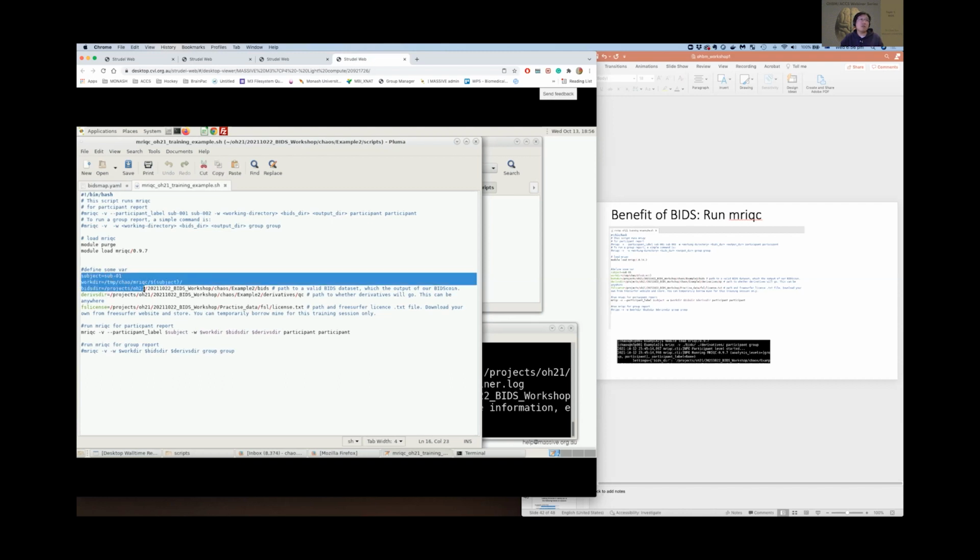And here is the variable design. It's like if you use MATLAB, etc., you just assign some information to a variable. So that's subject one, and that's a variable. And then here you just need to have a working directory. This can be pointed to anywhere. If you forget about it, it just points to a work directory in here. It's called work. It's random. And then here's the most important thing: the input of MRIQC. It's actually exactly the output of the BIDS folder you created. So you're done. And the output, you can accept, that's just the folder you just created.